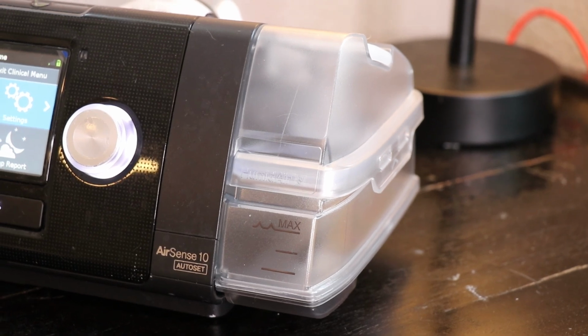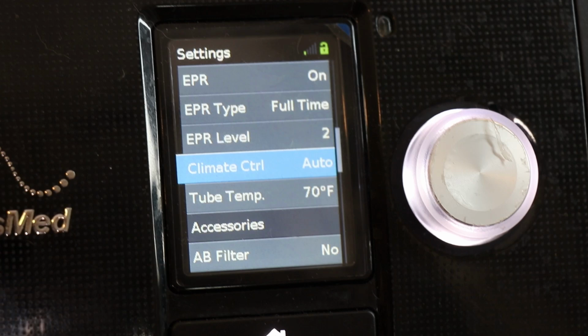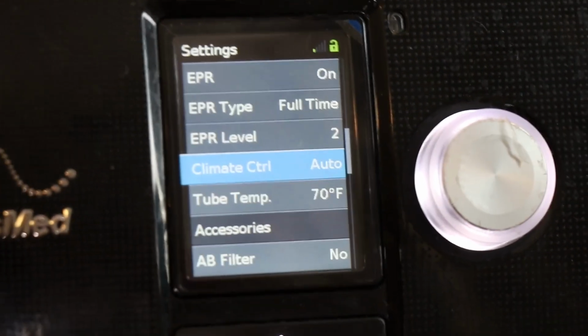Number 2, during a power outage, make sure that you disable the humidifier and the heater on your CPAP. The heater and the humidifier take up the most amount of power when using your CPAP machine. Typically, your CPAP machine is set to auto for both of these, and you don't really think about it because it's just connected to your wall outlet.